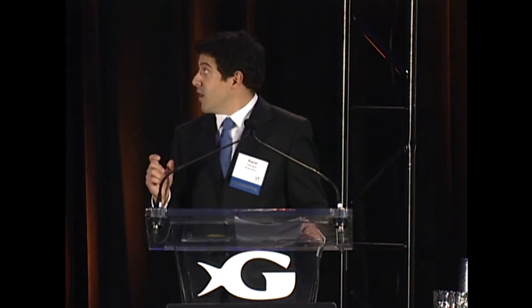They do an audiogram, which is where they put headphones on you and play tones and diagnose if you have a hearing loss. And they also do silicone impressions. Silicone impressions begin by placing a cotton stopper deep down in the ear canal, and then they fill your ear with silicone. You can see in the bottom left on the slide there's a pink thing. That's actually a silicone impression. Kind of gross looking, but that's how it's done today.